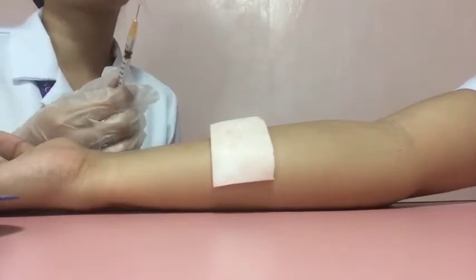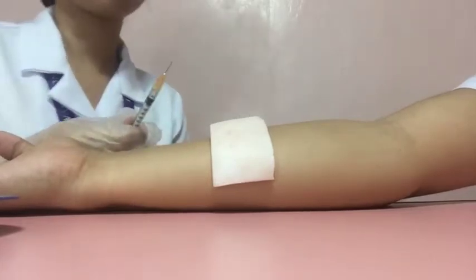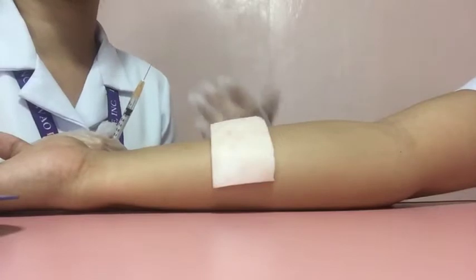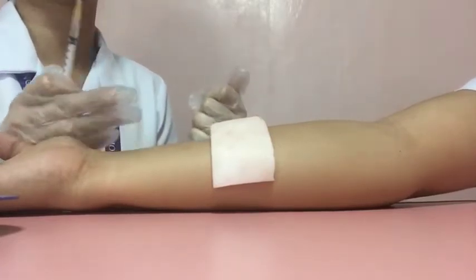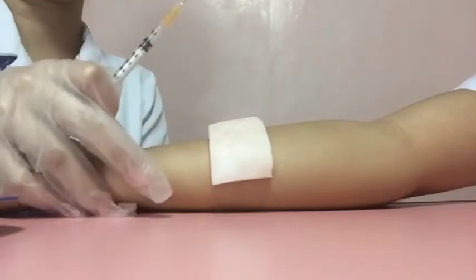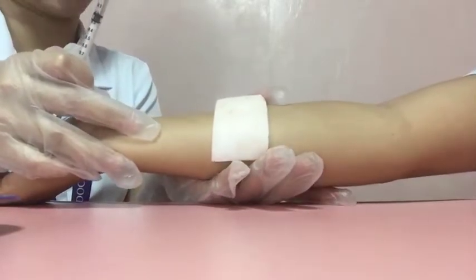So hold the needle almost parallel to the skin surface with the bevel of the needle up. So the possibility of the medication entering the subcutaneous tissue increases when using an angle greater than 15 degrees. So now let's proceed in injecting the fluid. So ma'am, mag-inject ako ma'am ha. Sige, ma'am. So with your non-dominant hand, pull the skin of the site until it is taut. So taut skin allows easier entry of the needle and less discomfort for the client.